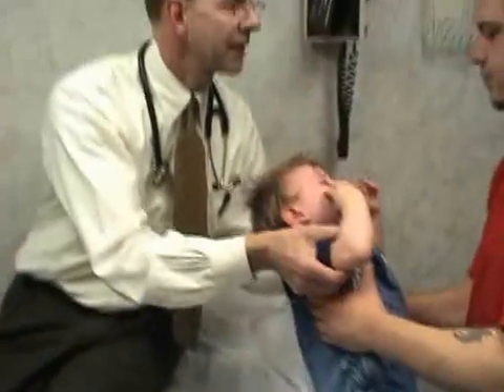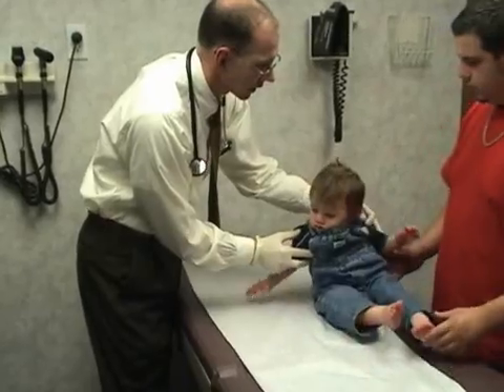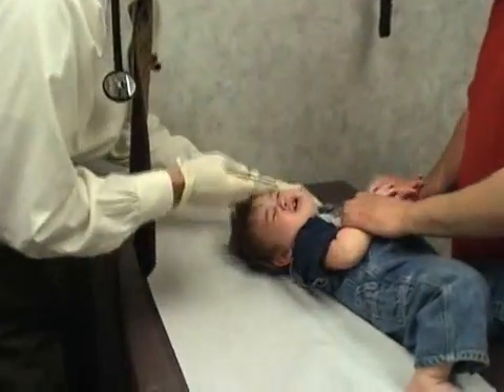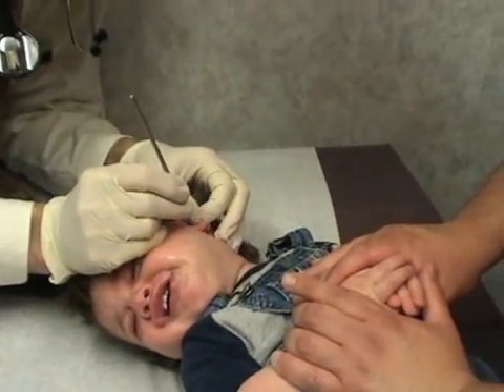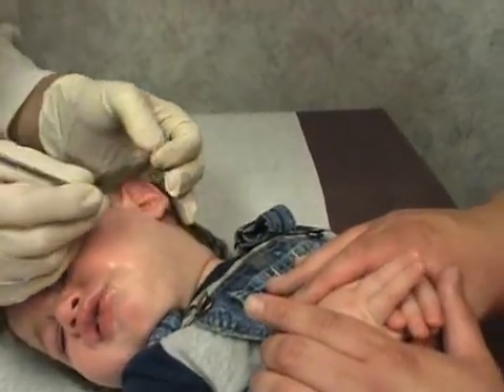Let's go ahead and lay back here again, alright? All the way back. You just kind of gently hold his hands here. Here we go. There we go.